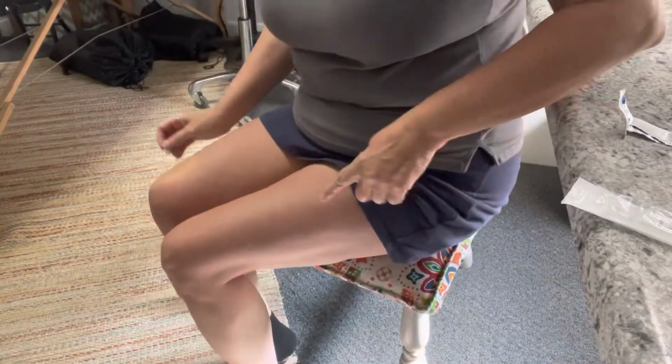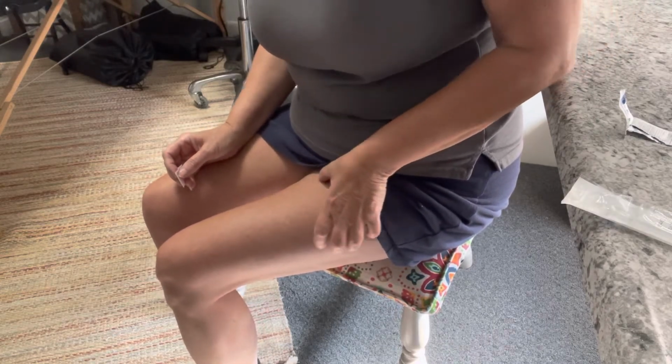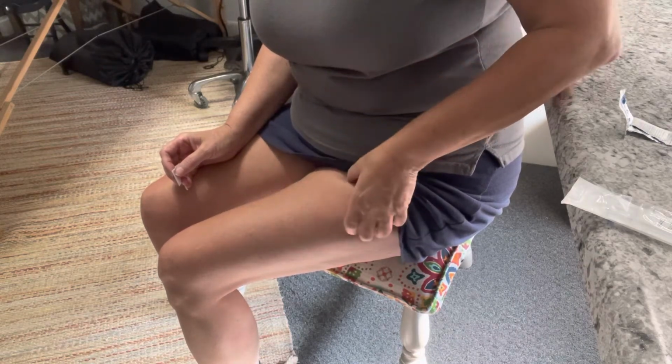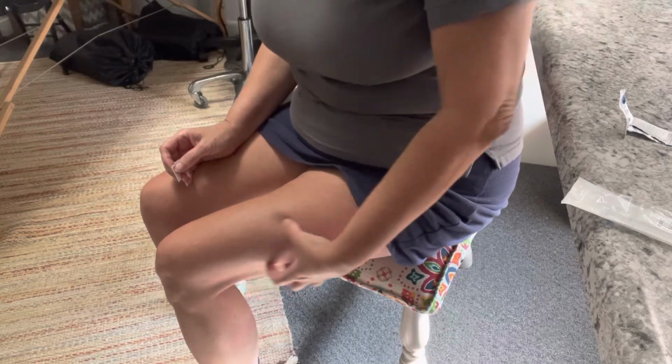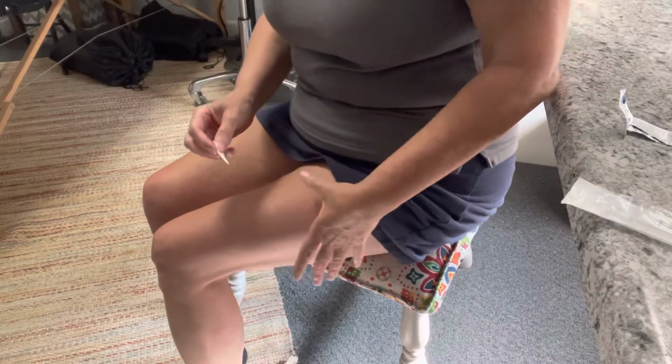While we're waiting for the alcohol to dry on my bottle, I am going to change our video to my leg so you can see me work here. Okay, so we're going to inject a little spot right about here on my thigh. Intramuscular medicines go into the muscle, so you can use the top part of your thigh or the side part of your thigh. You could also use your shoulder. I'll show y'all that in just a minute.